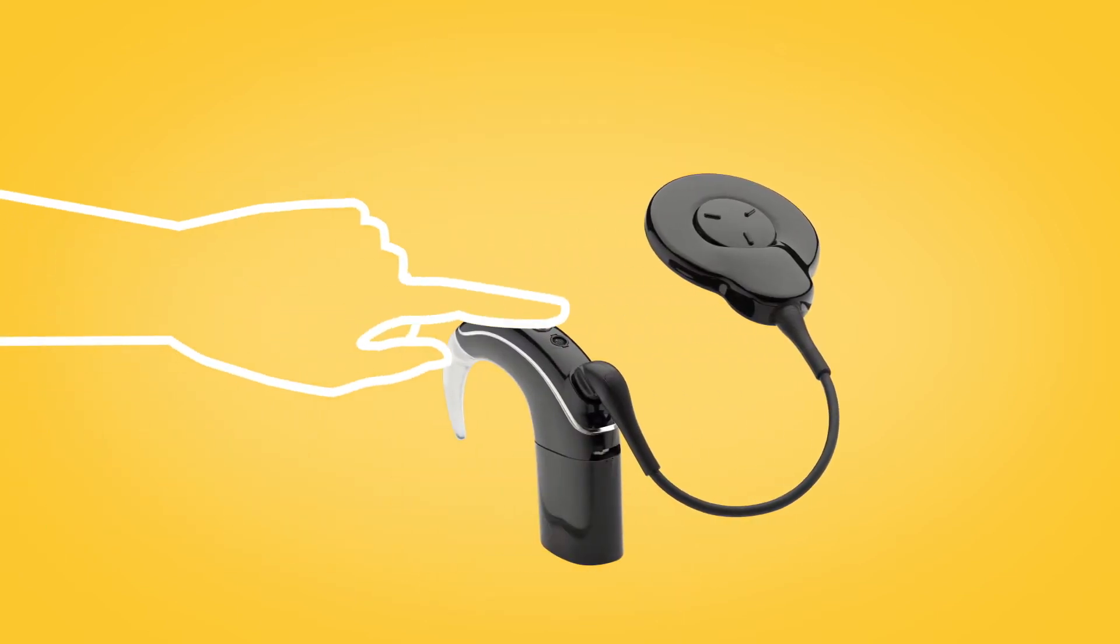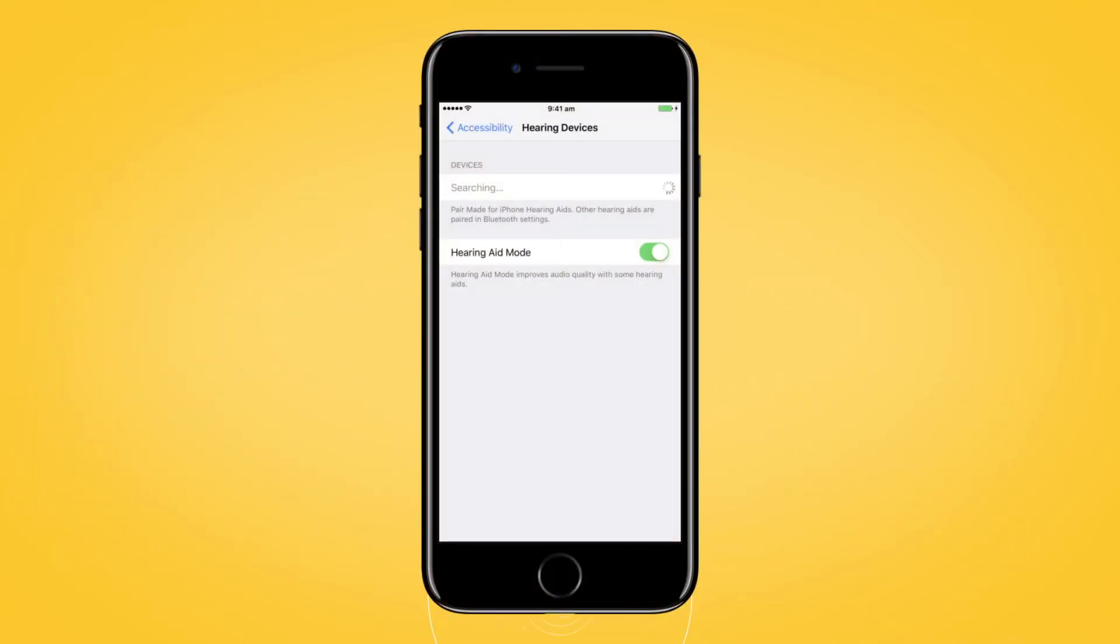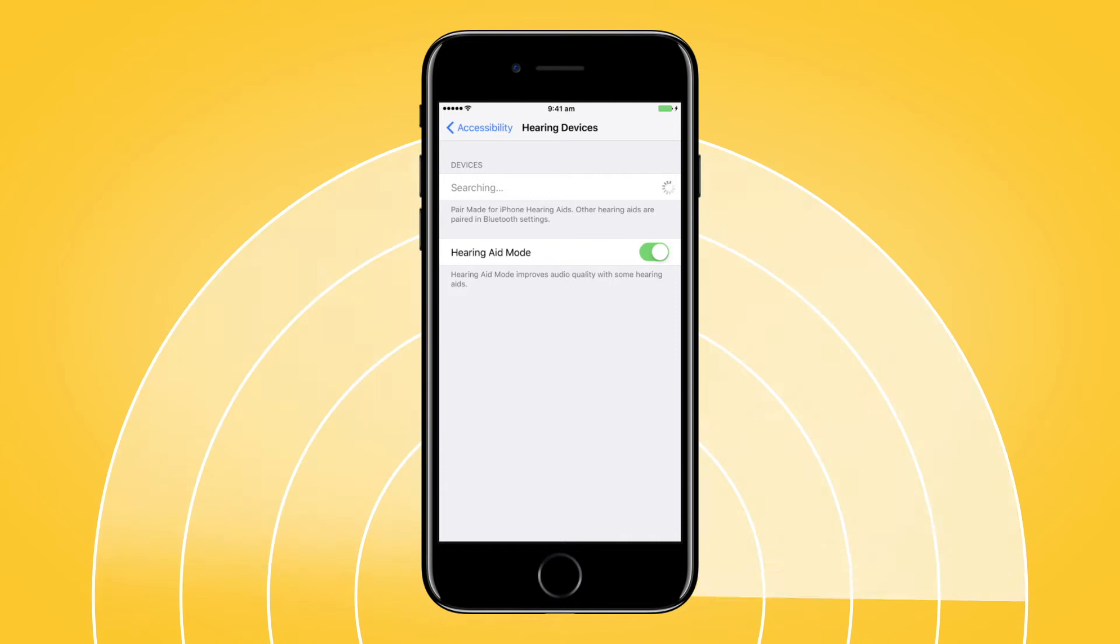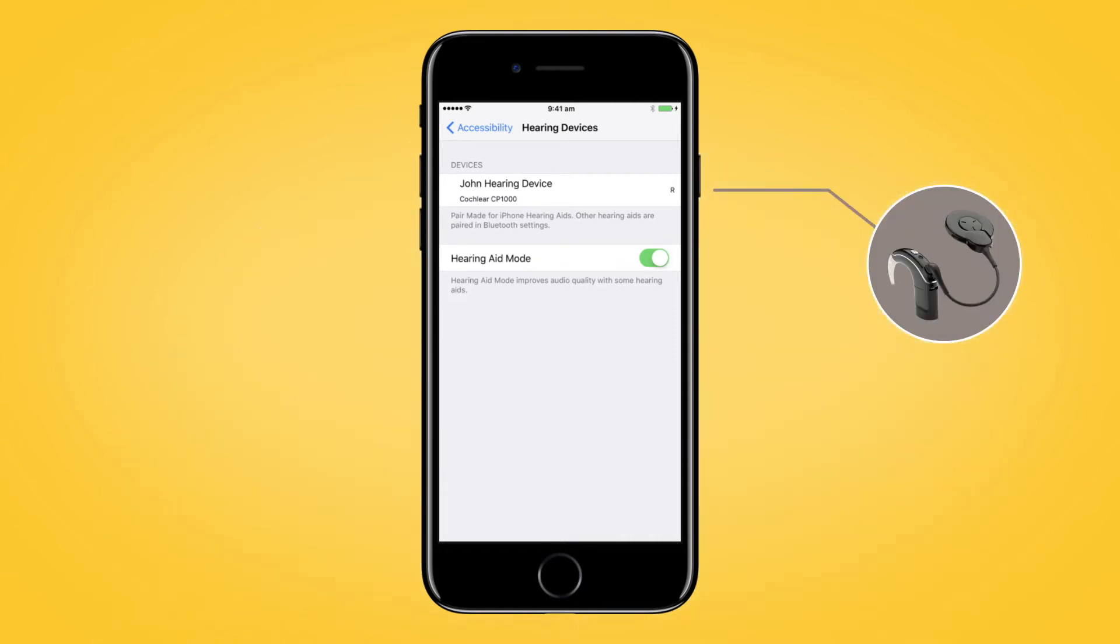Next, turn your sound processor off and back on again. Your Apple device will then search for your processor and display it here in the Devices section.